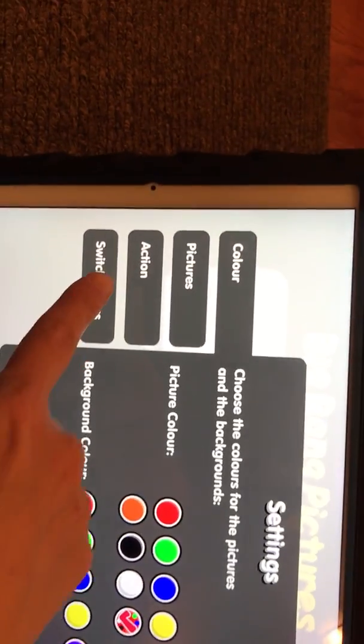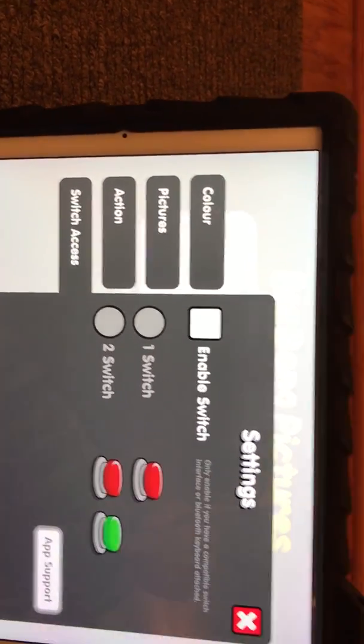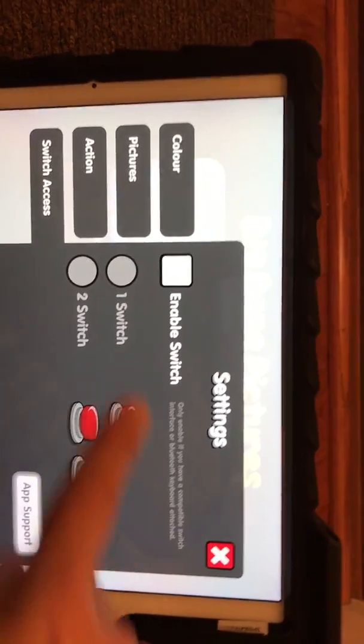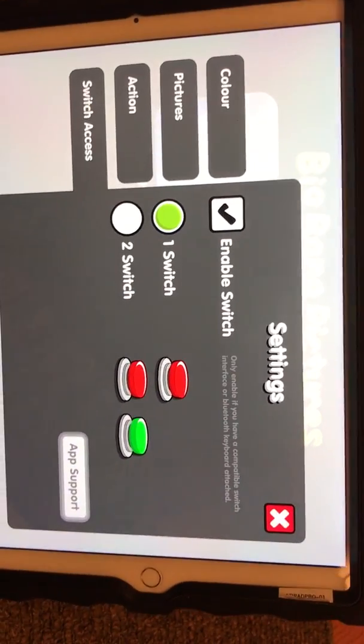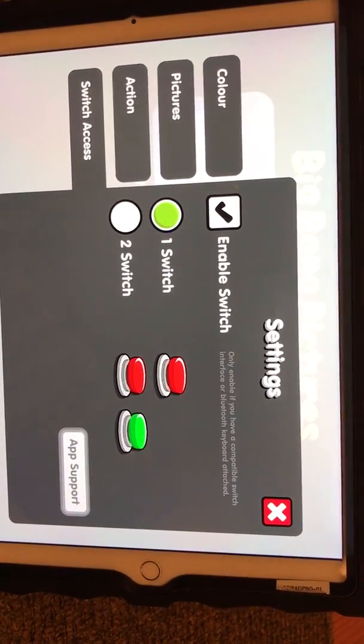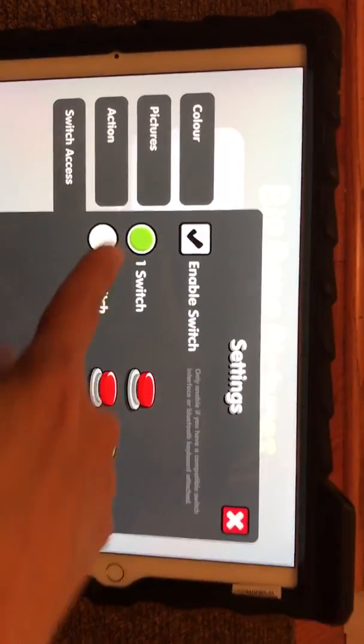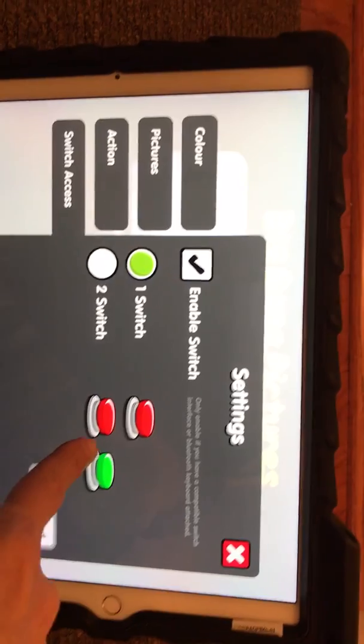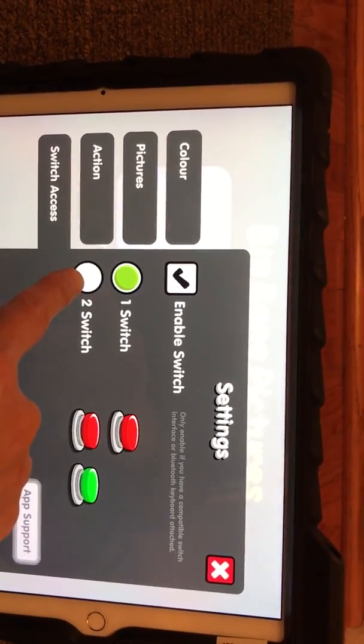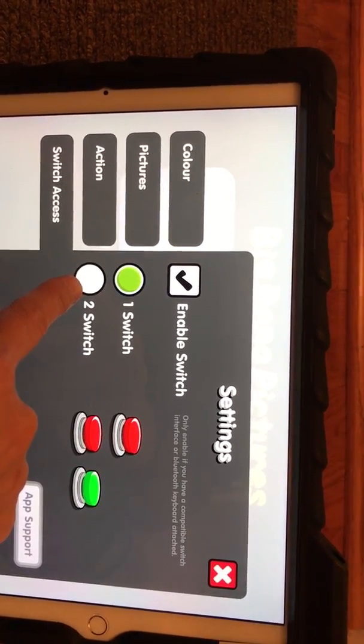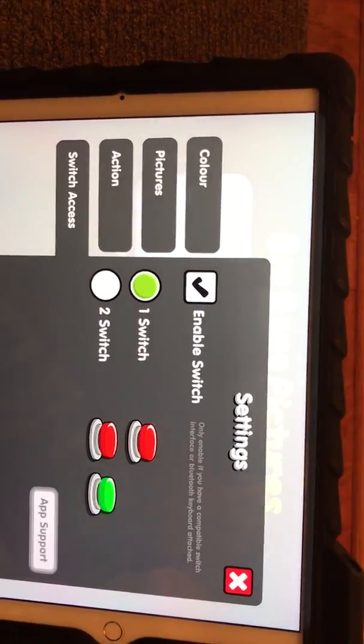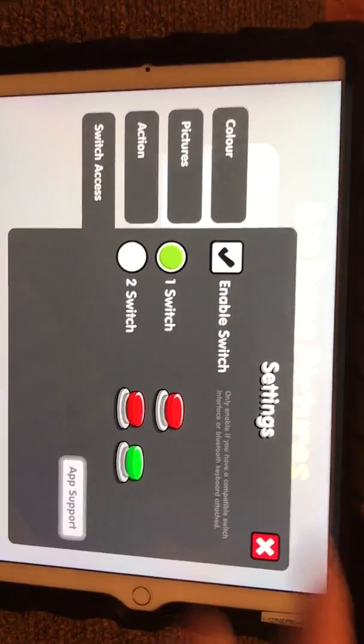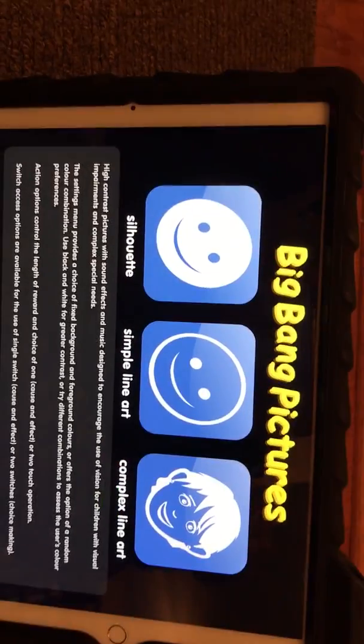The next thing you'll need to do is click Switch Access and then make sure you're enabling your switch. We're only using one switch, so you can click one switch. If you have two switches so you can use a mover and a chooser, you can click two switches. We have one, so we're going to do that and click out of it.